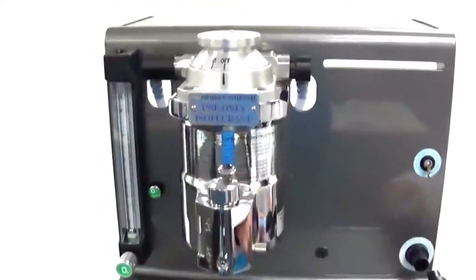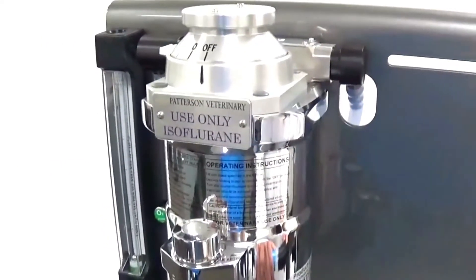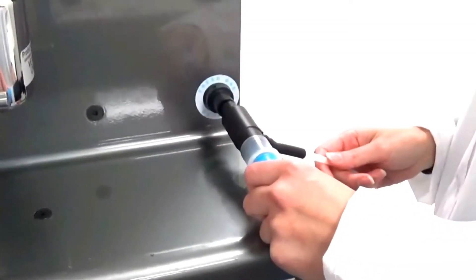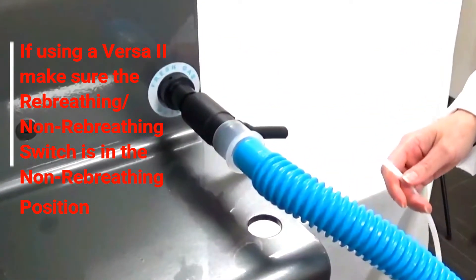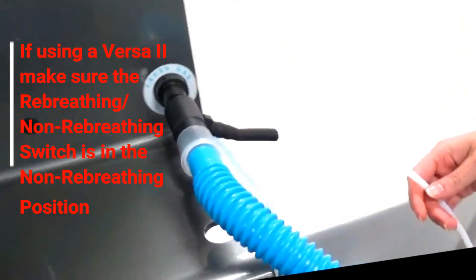If it is difficult to get to the outlet side of the vaporizer to remove the end cap, another option is to connect to the fresh gas outlet using the other side of the gas sampling tee — the 15-millimeter tapered side — and attach it as shown.